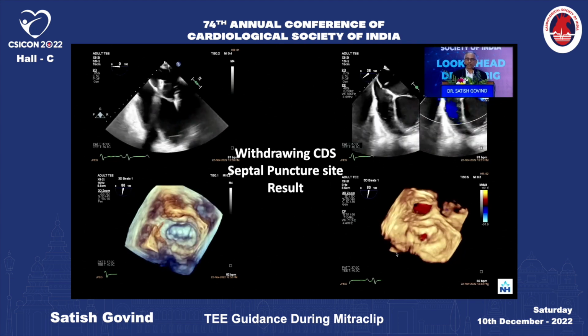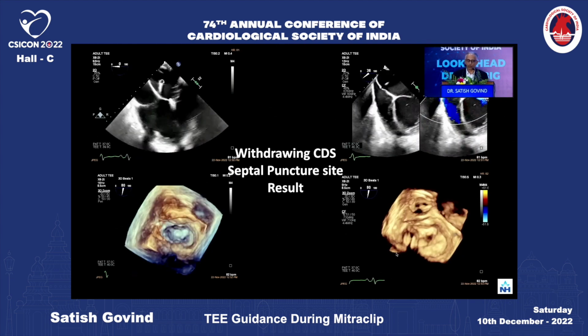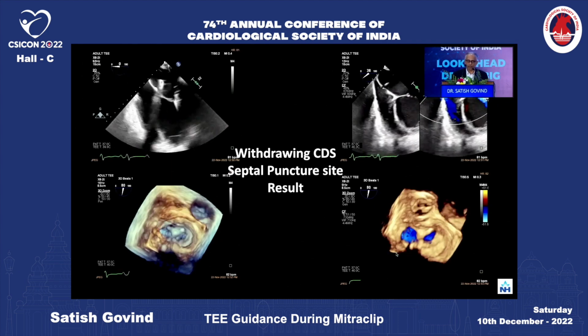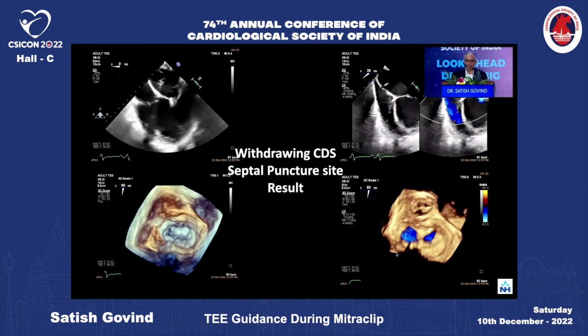And here again, one has to be careful because now it has got its sharp edges, what they call a spear. So gradually it is taken out. You don't want any damage to the atrial wall. And then finally it is taken out.